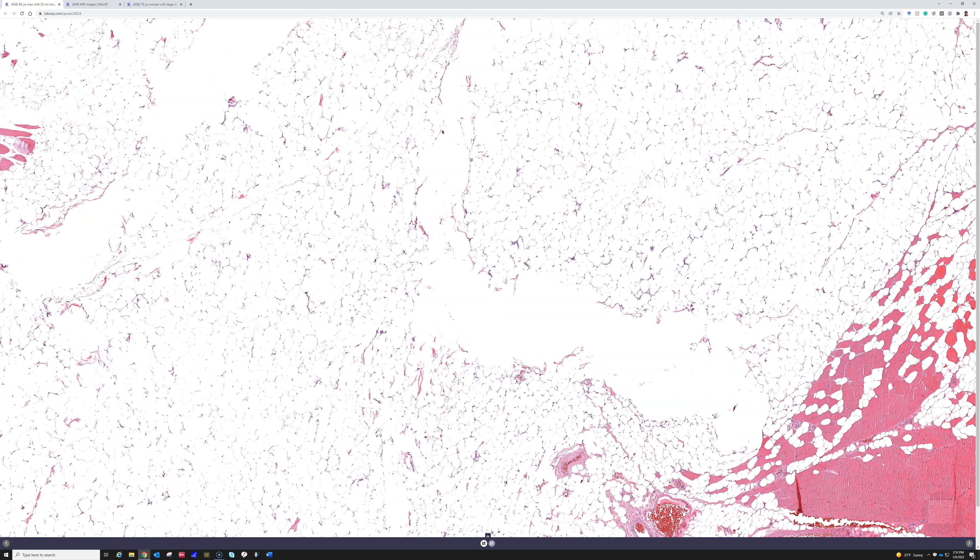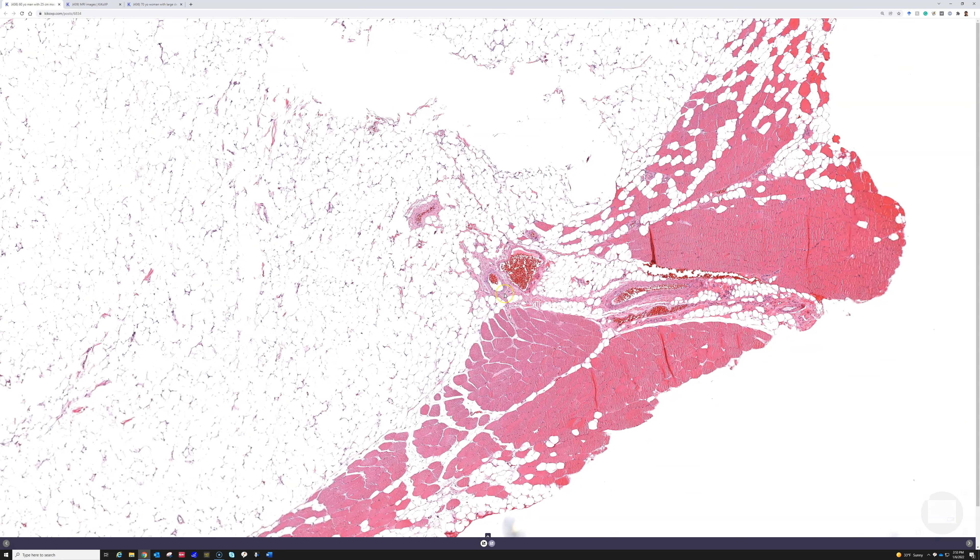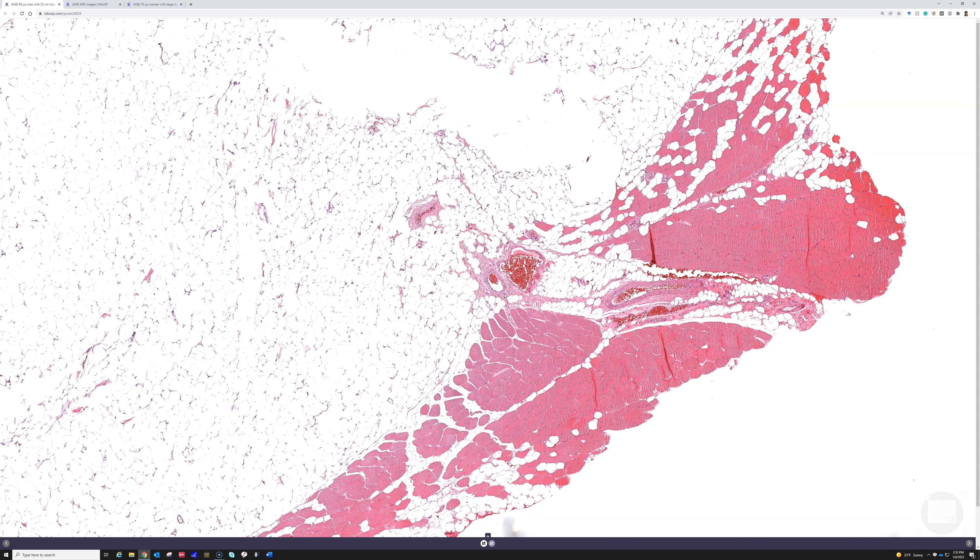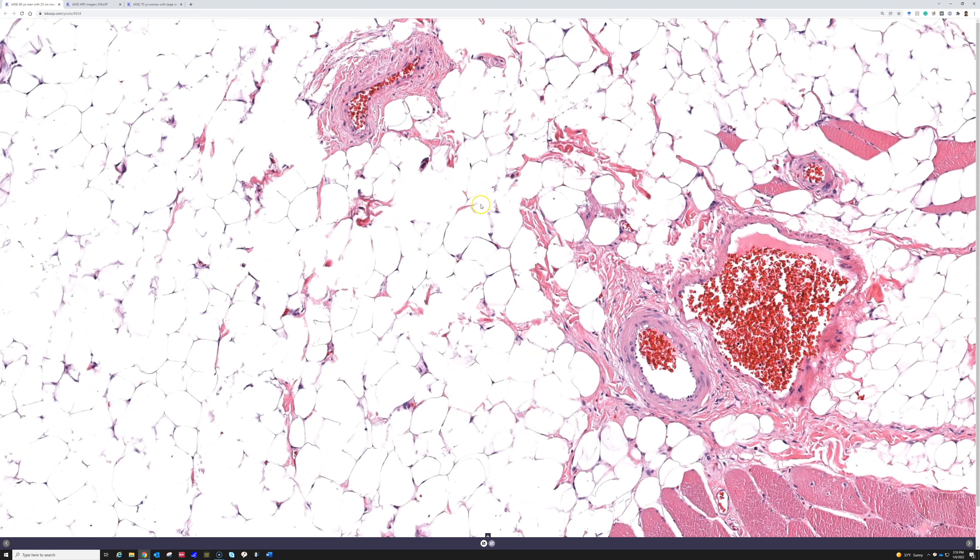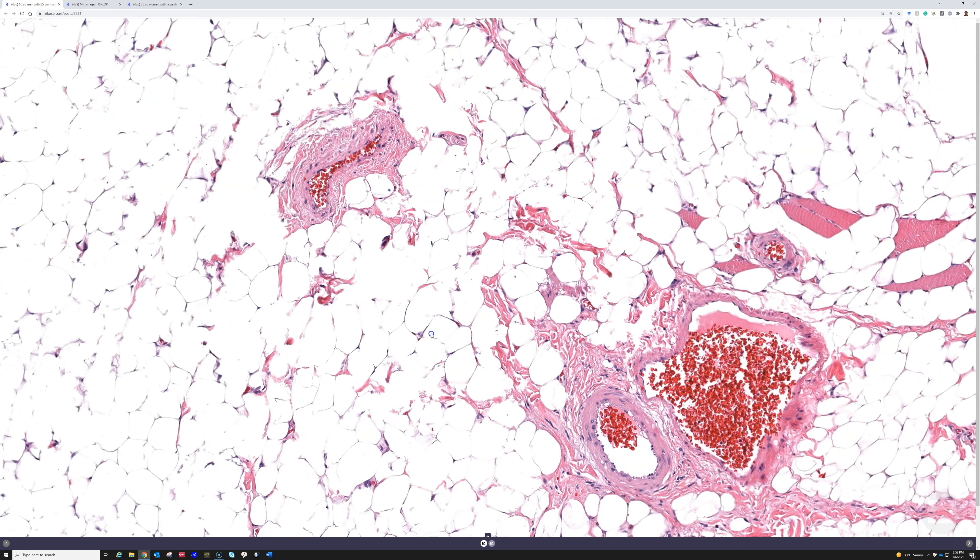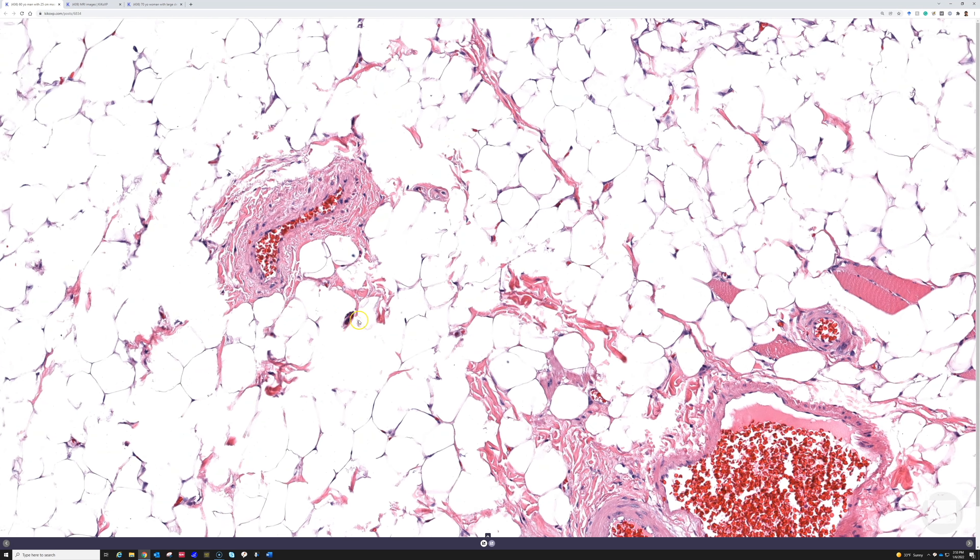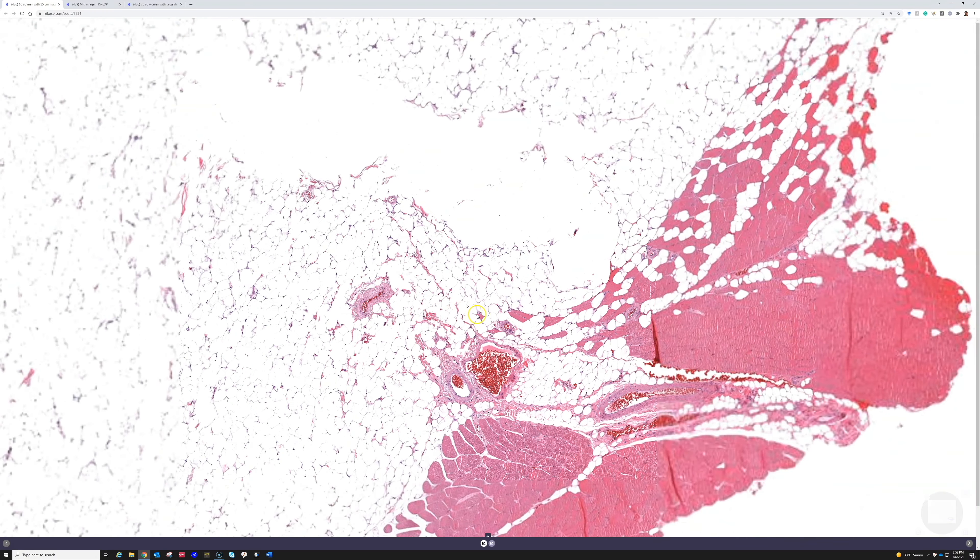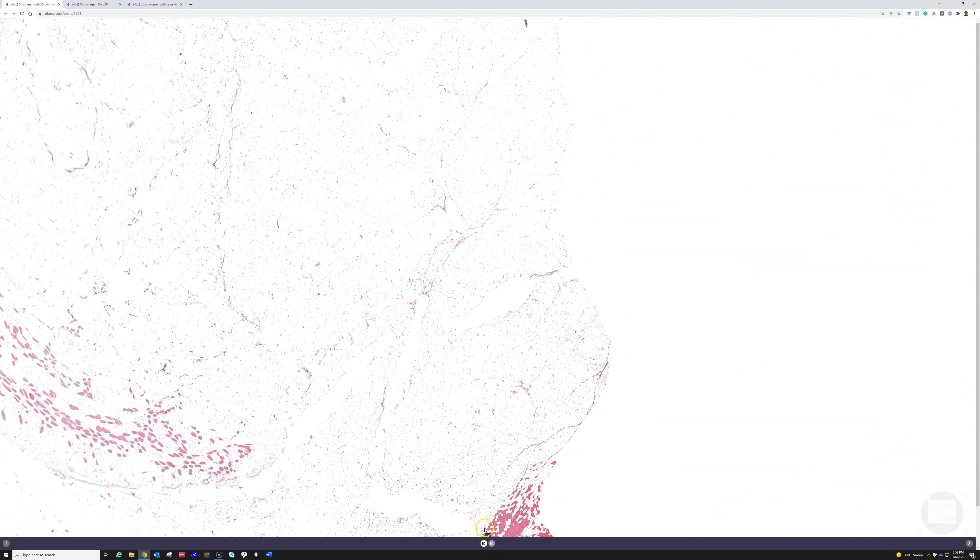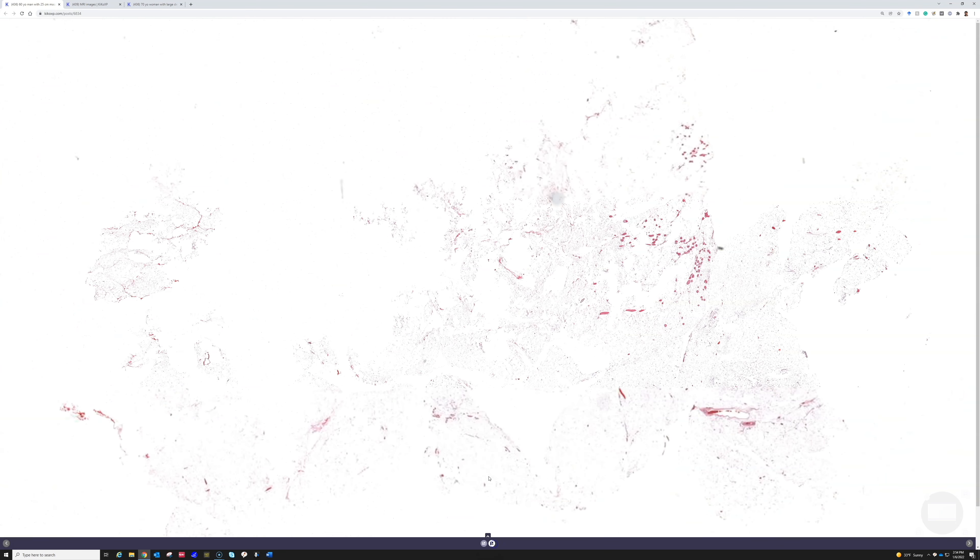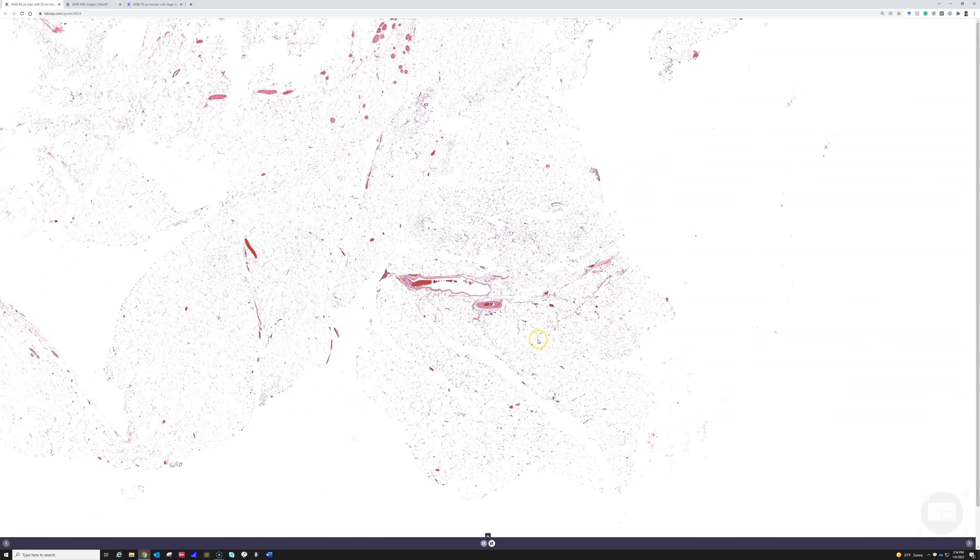So because of that, on large cases that look like lipomas I tend to do MDM2. And I have a full video about liposarcomas that you can go check out if you're watching this at home that goes into more details about when to do MDM2 or when I do it. So here sometimes you do have to look around carefully to find the atypia.